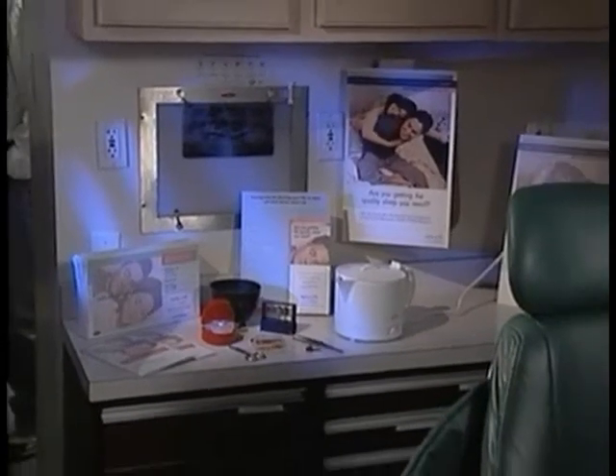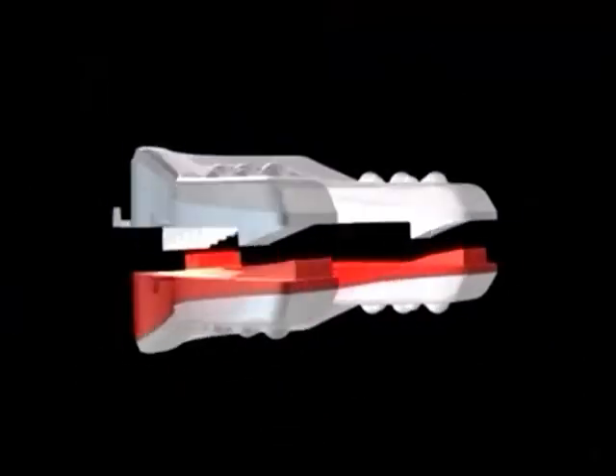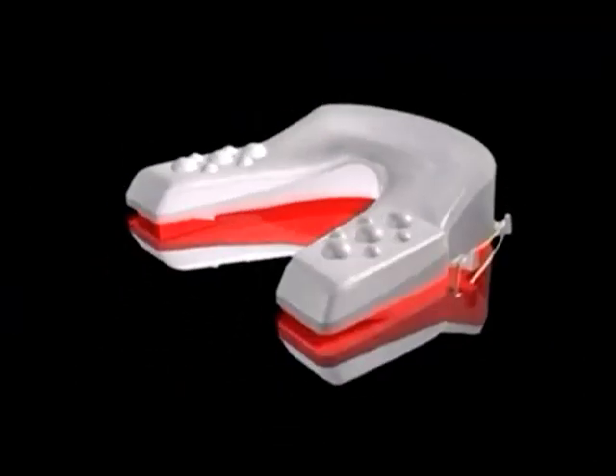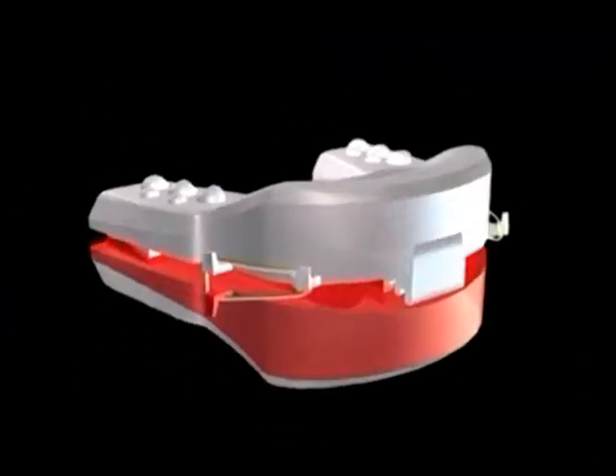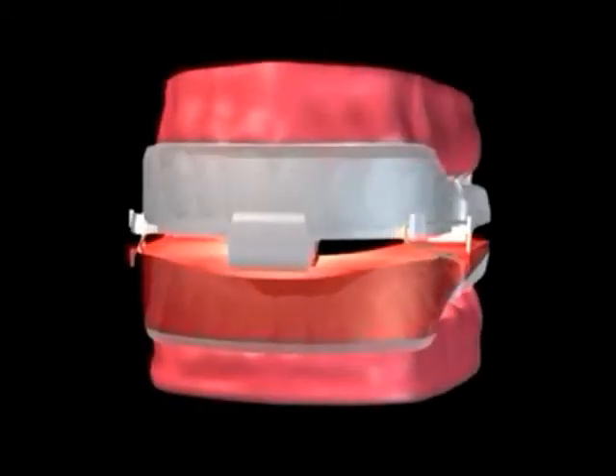The NORAD appliance is fabricated chair-side in less than 30 minutes. NORAD's two-piece tray construction provides a hard acrylic outer tray for durability and adjustability. The inner thermal elastic portion offers a comfortable custom fit and maximum retention.